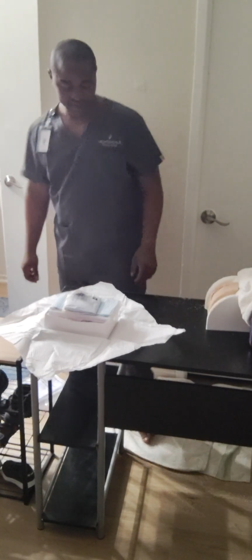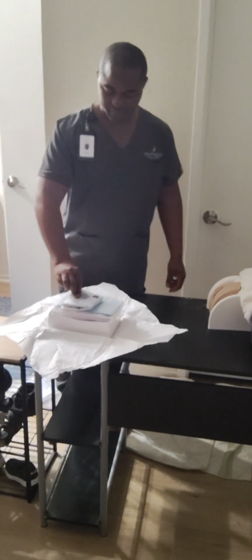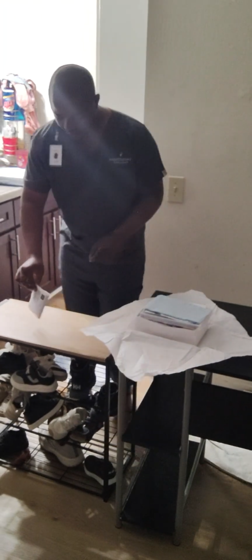At this time, I'm going to grab my sterile gloves. Open up my sterile gloves.